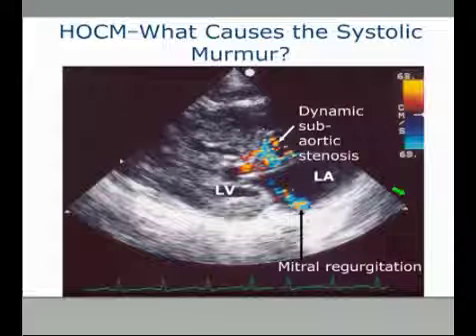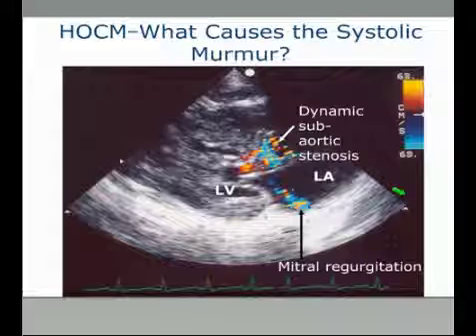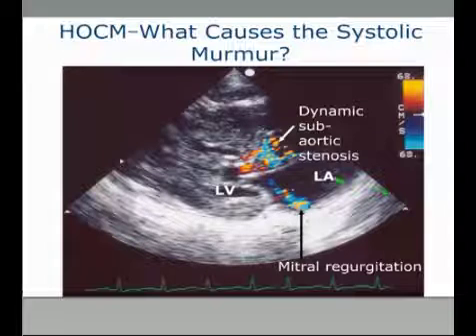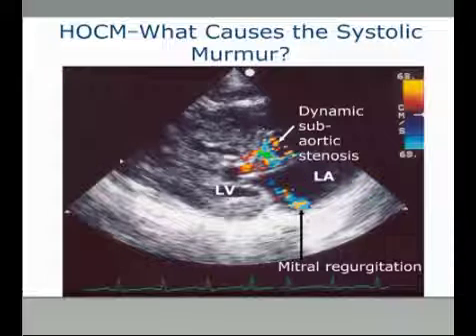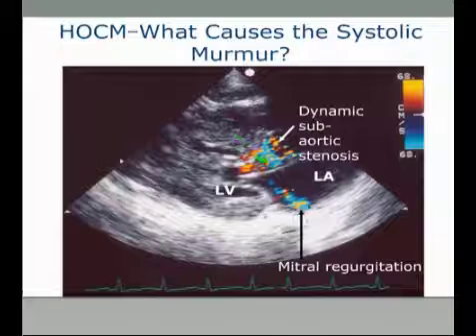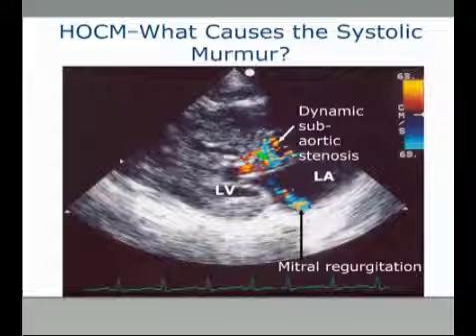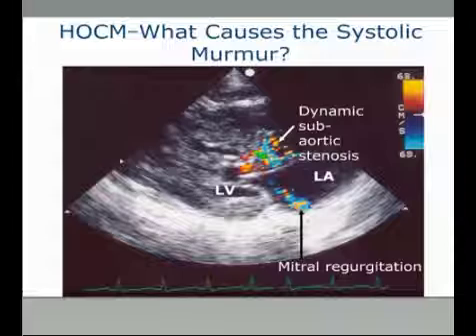So here's a still, and we're going to look at a movie in a minute, of dynamic subaortic stenosis on color flow Doppler. Color flow Doppler is a way of looking at the blood flow in the heart and looking for turbulence. This sort of speckled mosaic of colors tells us that the blood is moving at a fast speed and it's turbulent.